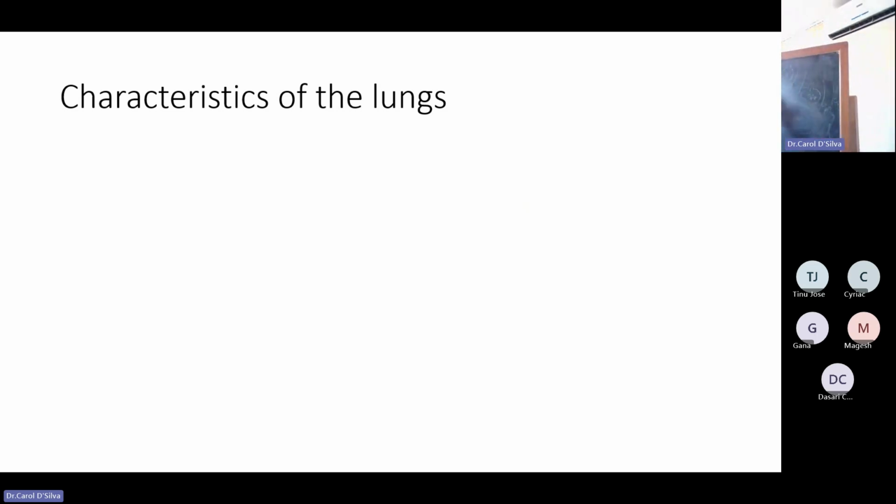So if I were just to show you over here, you have your lungs and the alveolus, right? The pressure over here is 0. You are basically creating a transpulmonary pressure gradient. How? By giving a positive pressure over here. And the pressure is also slightly positive over here, but this pressure is more positive as compared to here. Gas will move along the gradient, and therefore it moves inwards. So this concept of transpulmonary pressure is also important over here, but this pressure gradient is more important, your trans airway pressure gradient.